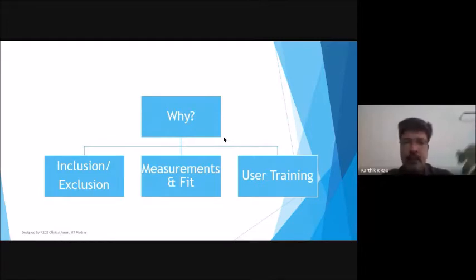The second thing is, when you are taking the assessment, we are deciding what should be the measurement of fit that is required. For example, based on their size, we might choose a bigger wheelchair and things like that. So some of the data that we are collecting through the assessment will help us in guiding the size of the wheelchair, the changes, the modifications and things like that.